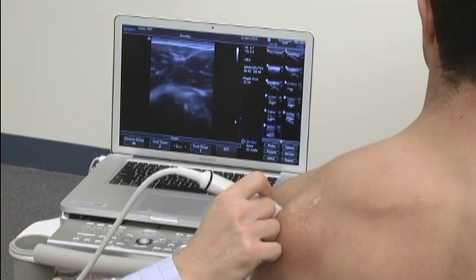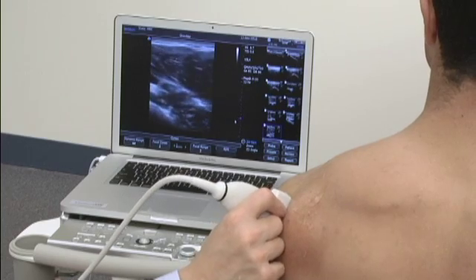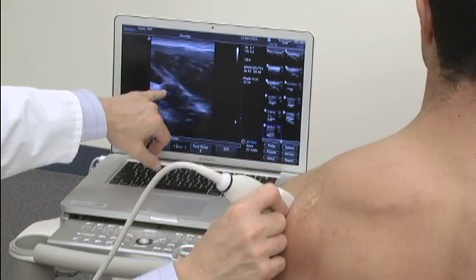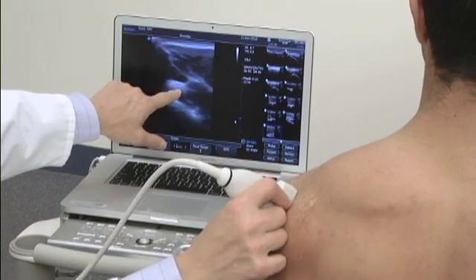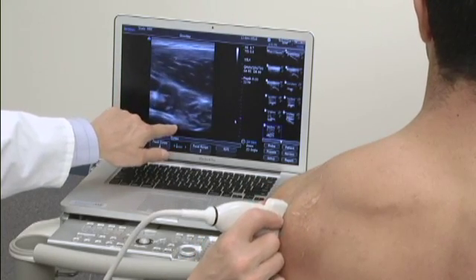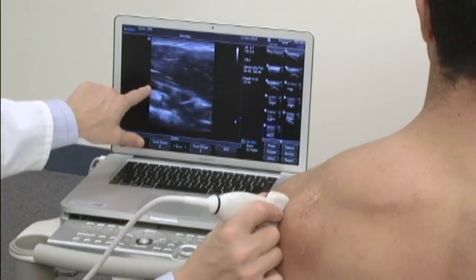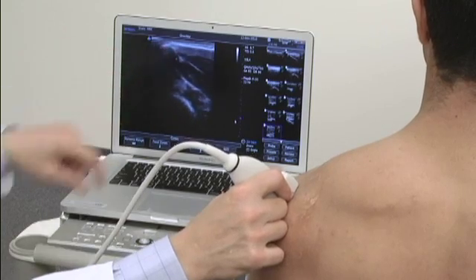These tendons can also be viewed in their short axis simply by rotating the probe. The infraspinatus will now be superior. I'm going to go up to where you can see the spine of the scapula, so you realize that just below it, the infraspinatus will be the first structure we see in this region. This is all deltoid here, this is infraspinatus, and then deeper down in this region is the teres minor. So: teres minor, infraspinatus, infraspinatus tendon, and there's the spine of the scapula again as I moved a little more proximally.